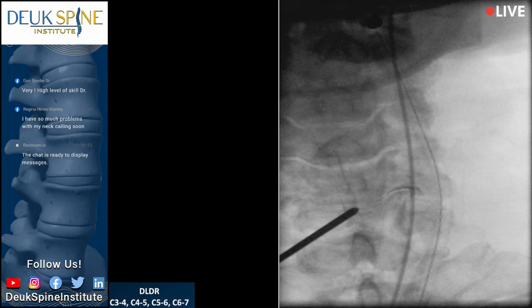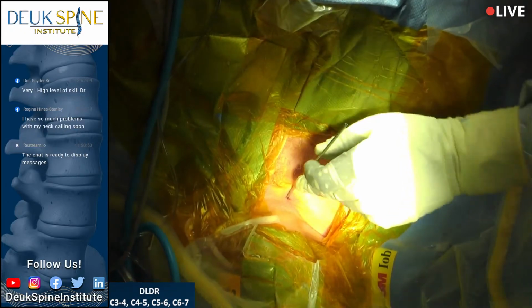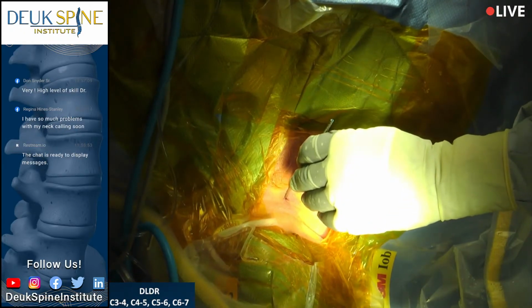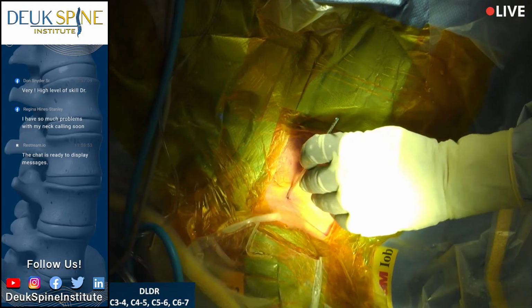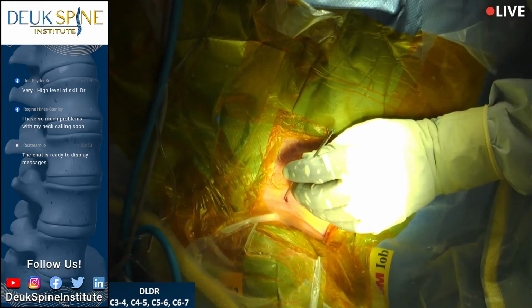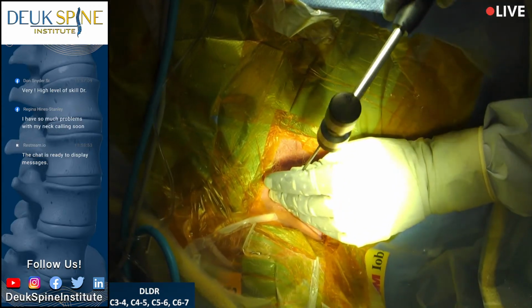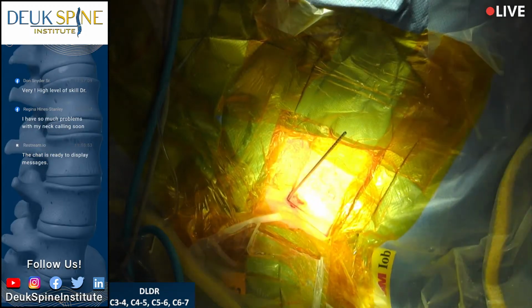Now we got to advance this. I will need a little more help when you get ready. Shot. Let's see what we can do without your pulling. That's pretty good. Yeah, nobody needs to do anything special. Shot. That's about as far back as I can go. Let's get the tube down.